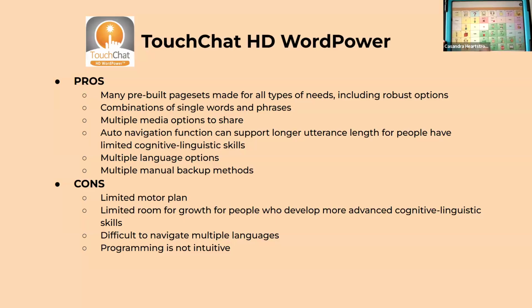Many combinations. So I have individual words, like I, help, and then also I have phrase-based language. That's funny. Oh my, leave me alone. That's a good thing about Touch Chat. It's got multimedia options to share. So meaning here in groups, and this is just an example.